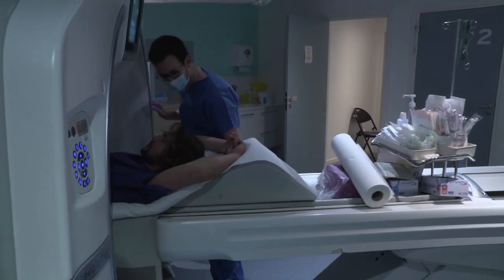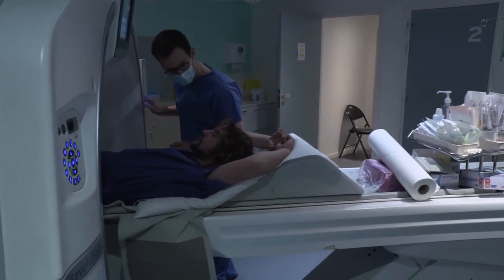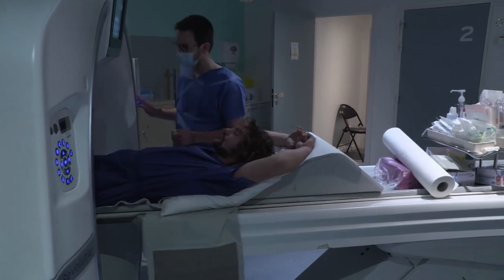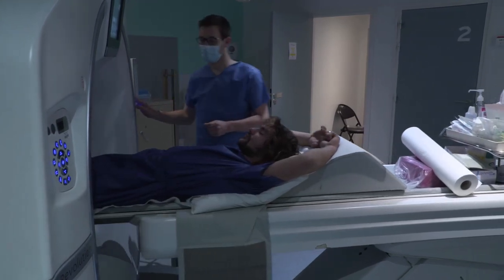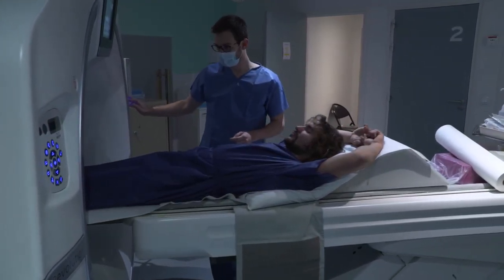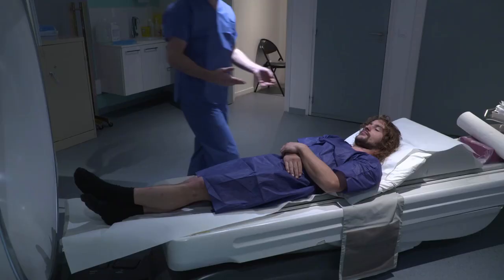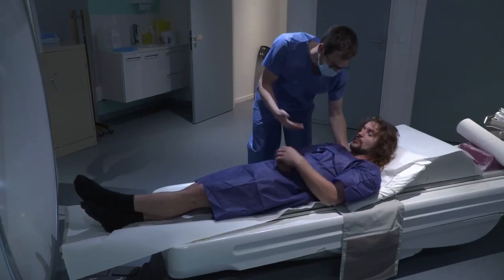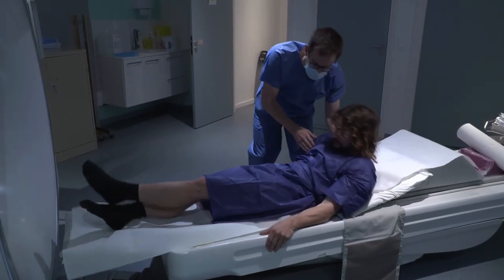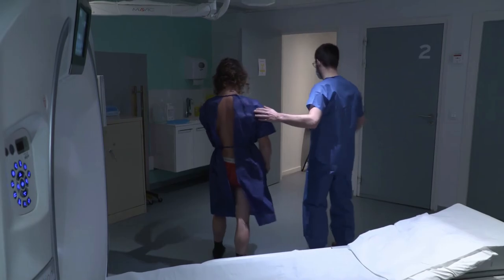At the end of the examination, accompany the patient back to the changing room and tell them they may get dressed. Provide the patient with any post-examination instructions as indicated at your facility.